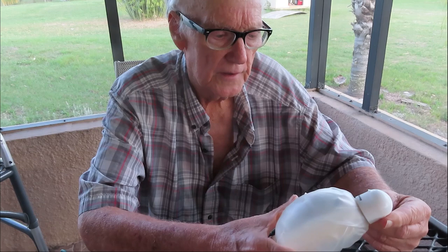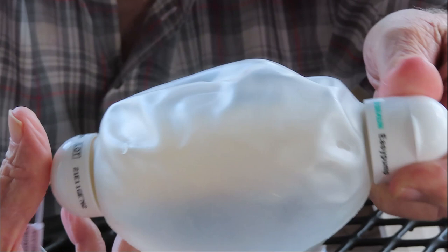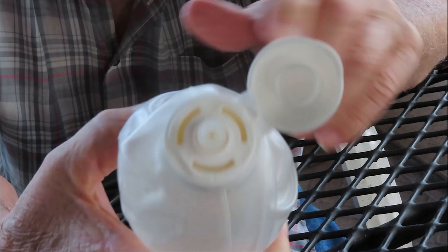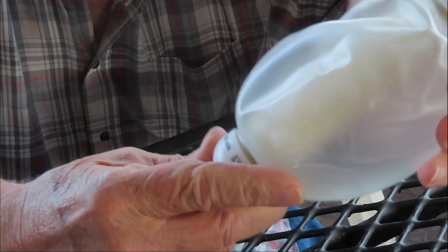What I have here is the IV that they use for home injecting yourself. It's called an easy pump. And these, I think, sell empty, like $20 or so. This is how they fill it. It's right here. This top opens up. You put the medicine in here to fill the ball. This one's full on here. This is a big ball. This is a 100 mil an hour ball.